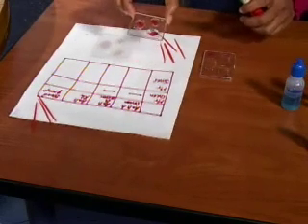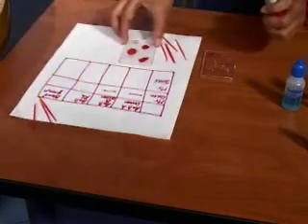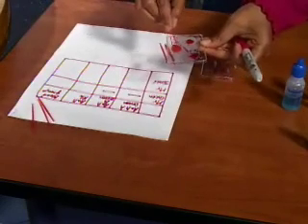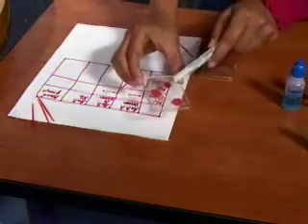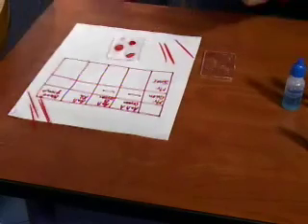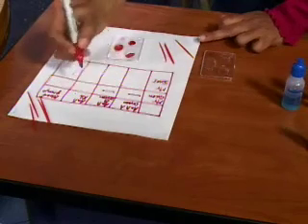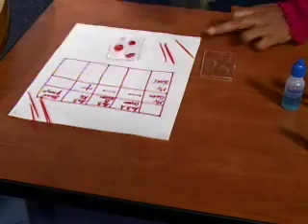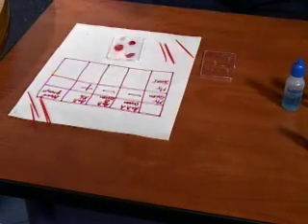Now in the third one, you may not be able to see from that distance, but actually on keeping it for a while, there is a slight amount of agglutination that you can see over here. It is not as clear as the other two. So there is agglutination up here. So that means the anti-RH serum, which contained the antibodies to the RH antigen, found the RH antigen, and hence there was agglutination. Now this is how you're going to map this out for the blood groups.